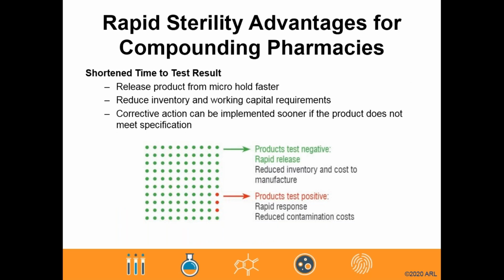In addition to gains in efficiency and production, an extremely noteworthy benefit to shortened sterility test times is that it offers the ability to perform investigations in a more timely manner. Rather than waiting 14 to 18 days for a traditional sterility test, being given an under investigation or a not sterile result closer to the date of production allows for a more effective investigation, as well as the ability to implement appropriate corrective actions sooner. With a faster response comes a faster recovery following any contamination event.